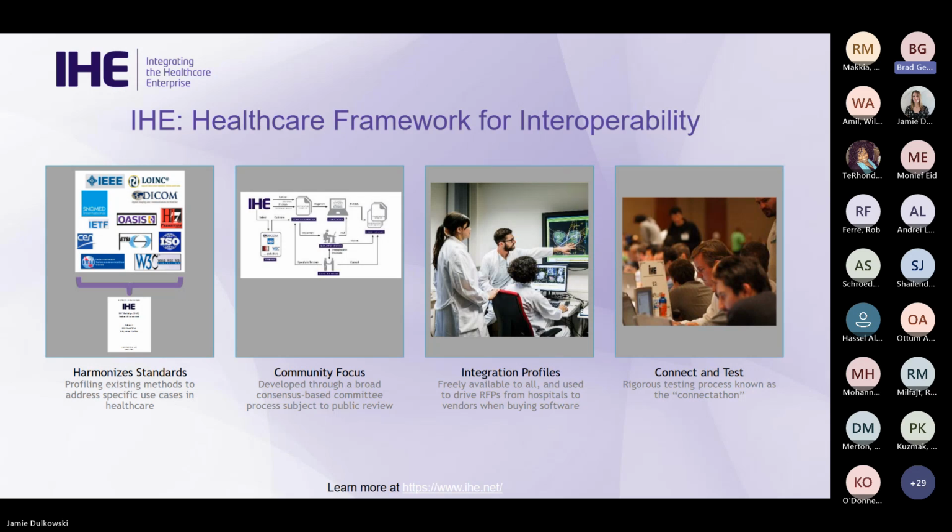The integration profiles that are created are freely available to all, and can be used to help drive things like RFPs, to help drive knowledge and awareness, to simplify and harmonize the way that we integrate different applications together in order to solve healthcare's overarching challenges, so that life is easy for physicians and ultimately for the patients.